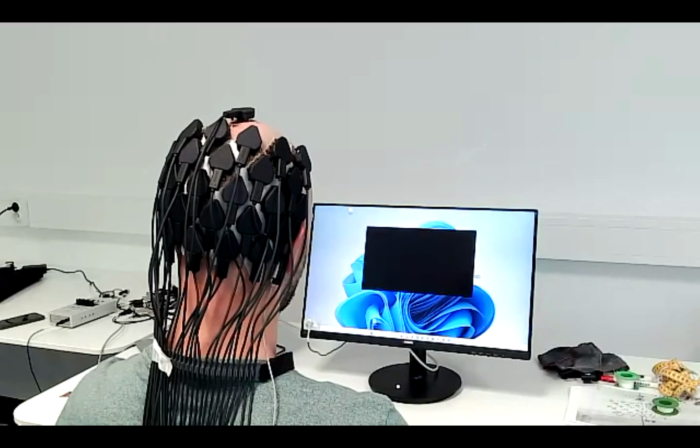So maybe you can do the next one. Yeah, okay. Another question is, what kind of g.tec product was used to map the topographies of the brain?